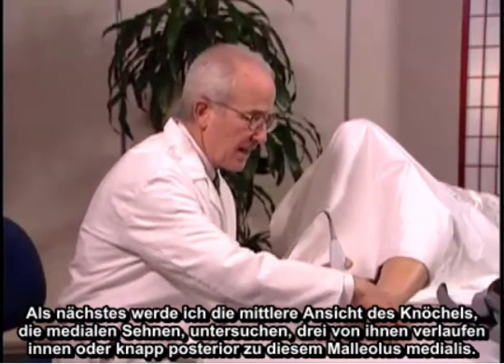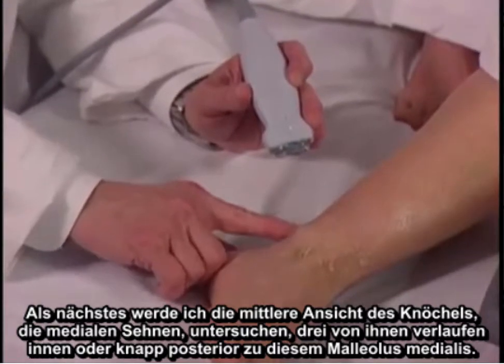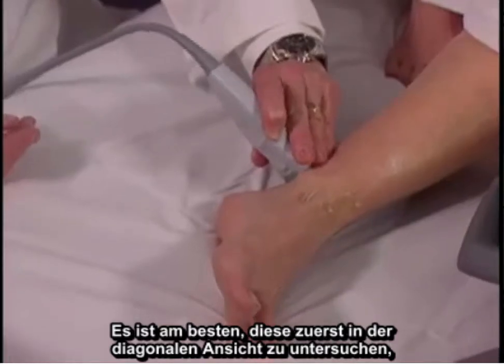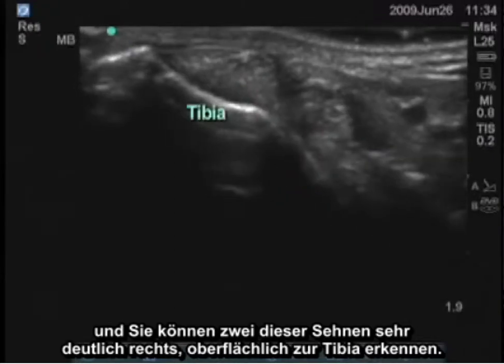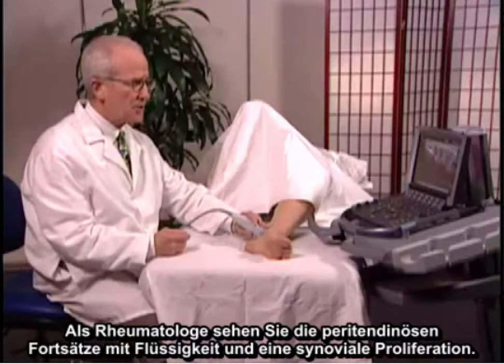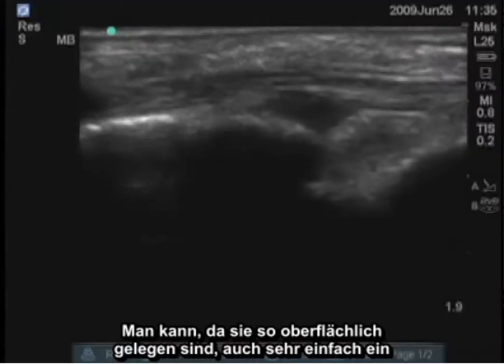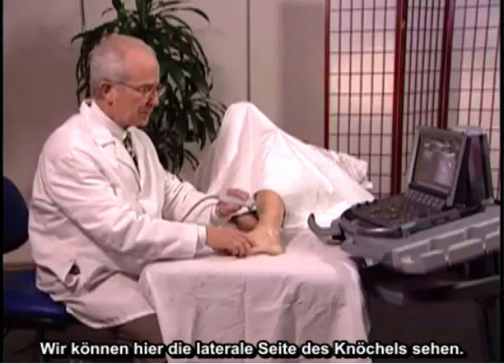Next, I'm going to examine the medial aspect of the ankle. Three medial tendons run just inside or just posterior to the medial malleolus. It's best to examine these initially in the transverse plane. You can see two of those tendons very clearly, superficial to the tibial bone. As a rheumatologist, you can see peritendinous processes with fluid and synovial proliferation, and you can also find large tears or tendinopathy. A longitudinal image of those tendons is also very easy to obtain because they're so superficial.